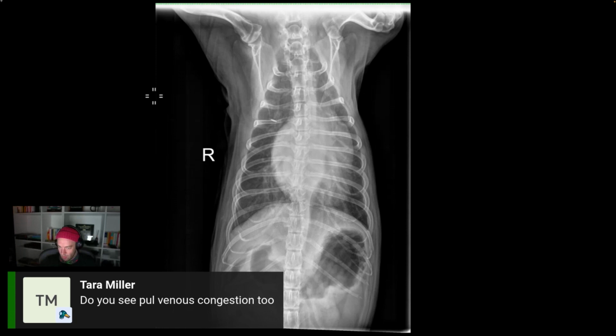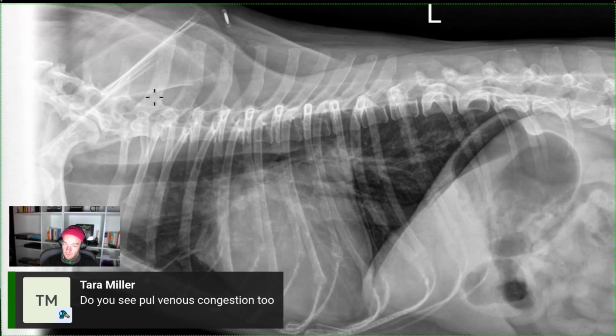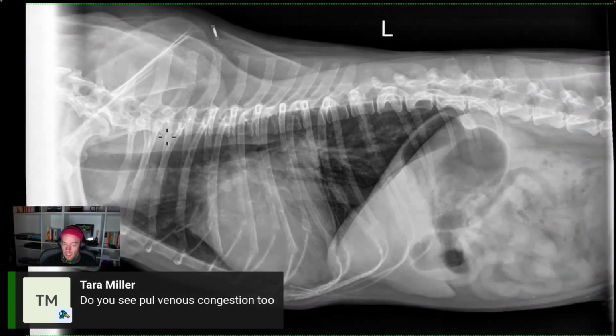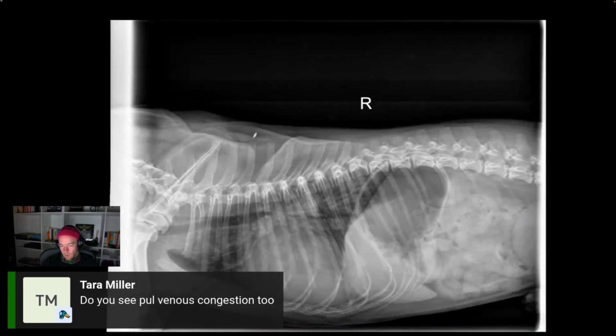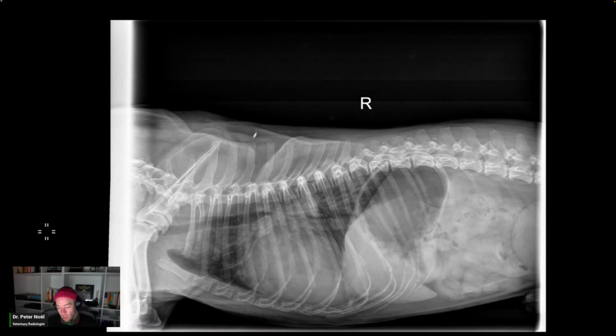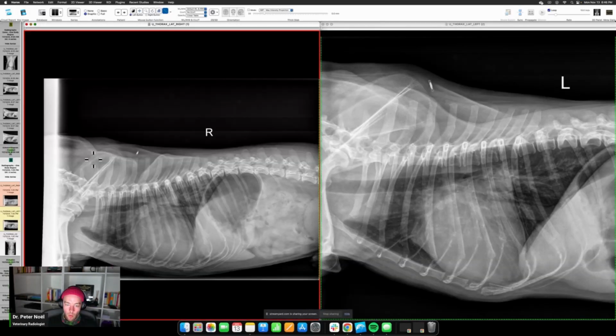Earlier there was an allusion to a very large urinary bladder. That's not a direct way, but maybe an indirect way, to infer the dog's been given Lasix, or maybe he's just trying to hold it in his cage and can't get outside to urinate. But some of these animals have been given Lasix, and that'll make those vessels decrease in size, because these vessels are skimpy. So I wouldn't bank on that. If you have them, great. If you don't, I wouldn't say, oh, well, then it can't be heart failure.